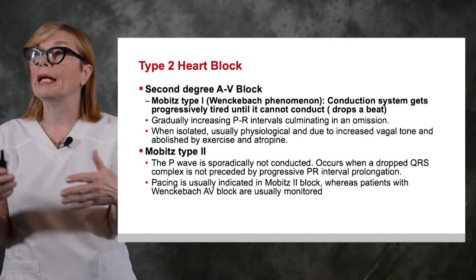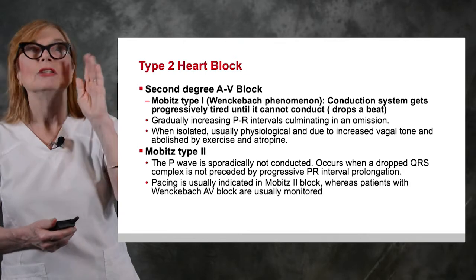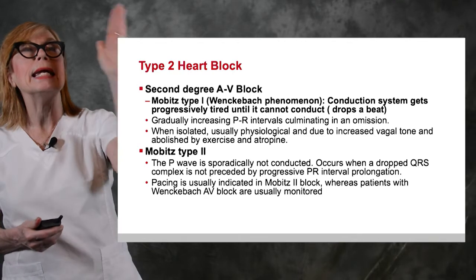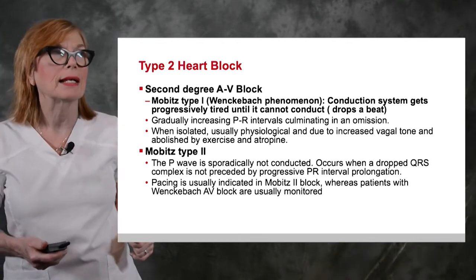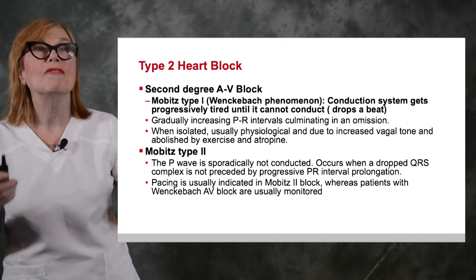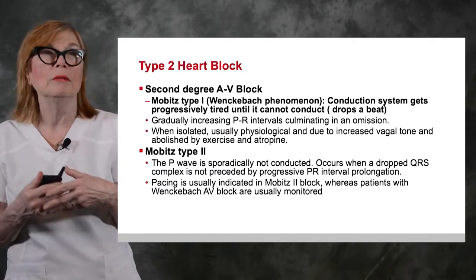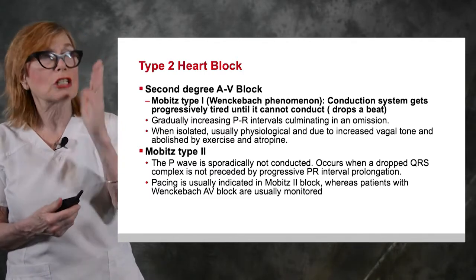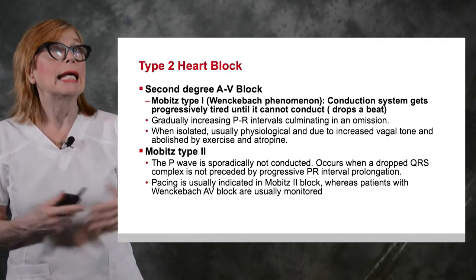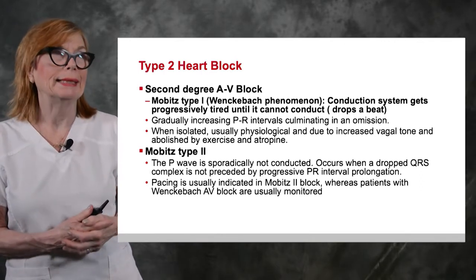And when we're evaluating our patient, what we actually see is our PR interval is typically constant. So that's very important. The PR interval is constant. The P to P rate is constant. What's inconstant is the R to R interval. Very, very important. So oftentimes with patients who have type 1 AV block, Wenckebach, we just watch them. This still tends to be a higher level AV junctional failure. It tends to be ischemic and typically does not require pacing.